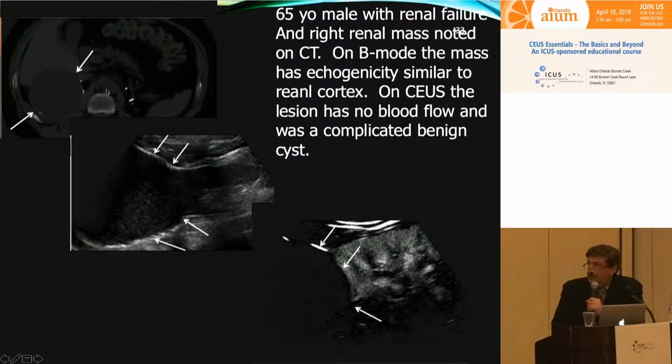Another lesion, CT, unsure if this is solid or cystic. It looks like it could be solid on ultrasound without contrast, but after we give ultrasound contrast, the lesion has absolutely no blood flow, and this turned out to just be a large hemorrhagic cyst.